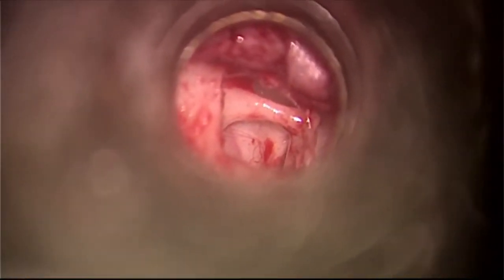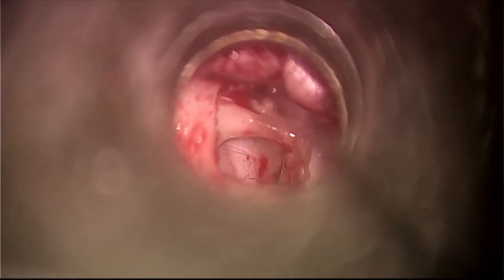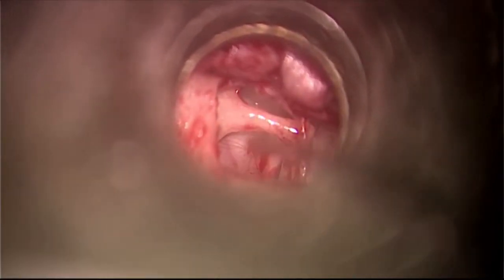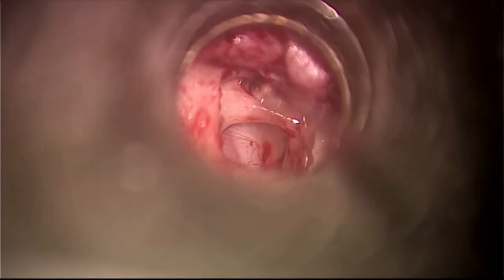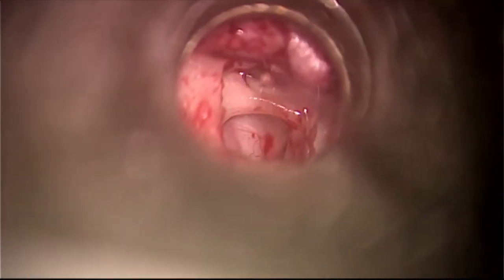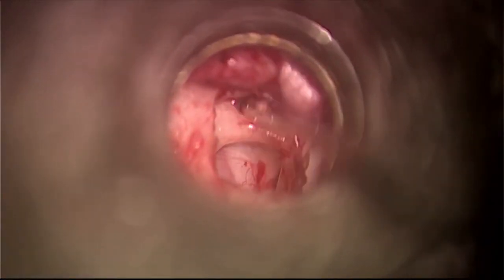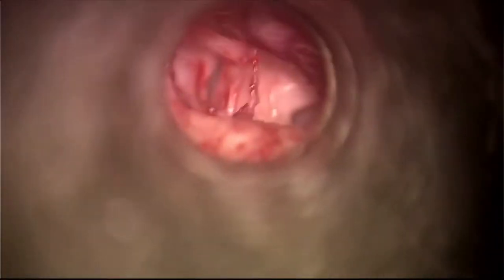You should see the base of the pyramidal process. You should not see the body of the incus. You should see the anterior ligament, and you should see part of the facial nerve. That is the malleoincudal joint, inferior part. Posteriorly, like Ashim said, you should be able to see the pyramid, and you should be able to see the facial canal.